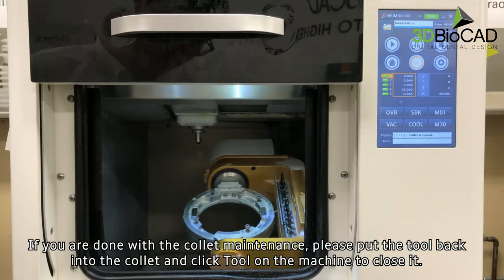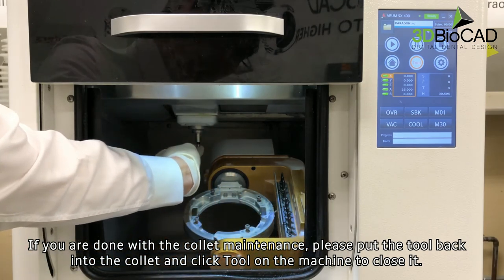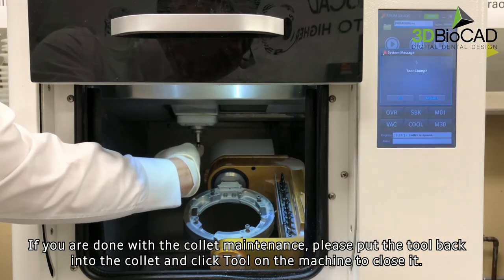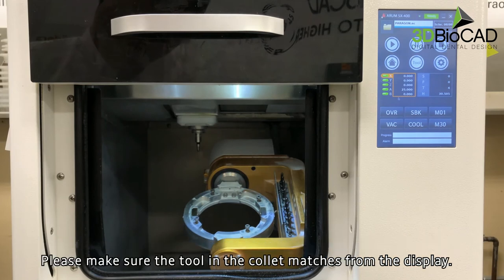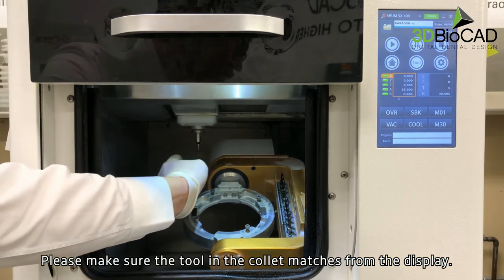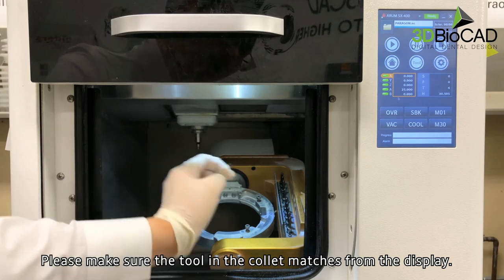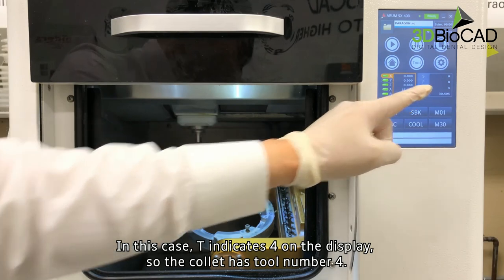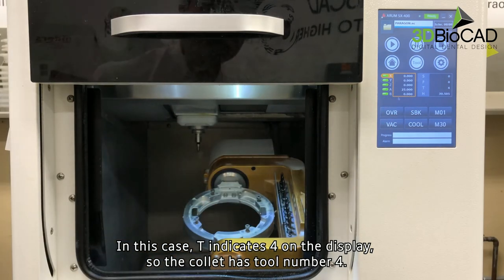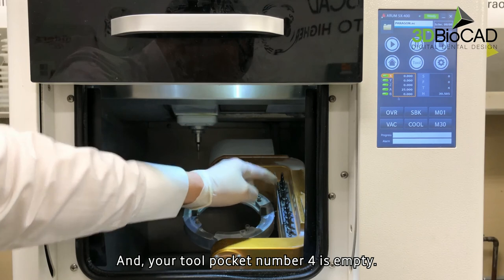If you're done with the collet maintenance, please put the tool back into the collet and click tool on the machine to close it. Please make sure the tool in the collet matches what is shown on the display. In this case, T indicates 4 on the display, so the collet has tool number 4, and your tool pocket number 4 is empty.